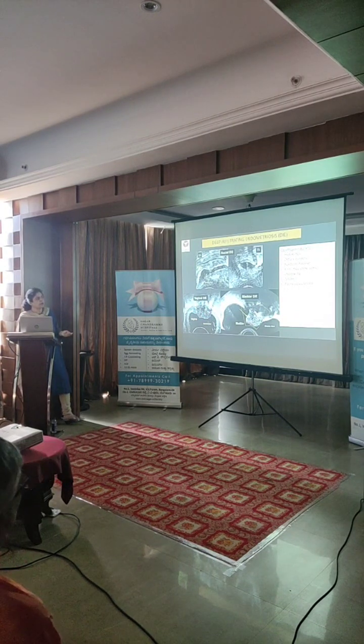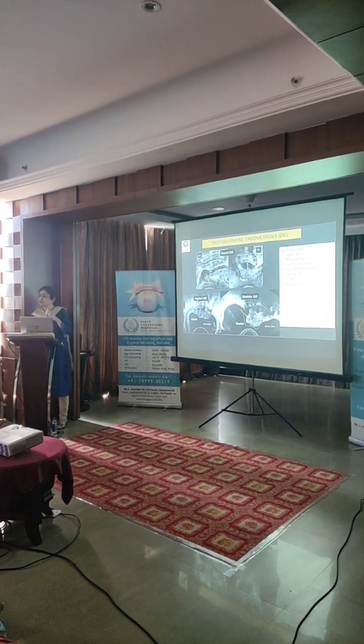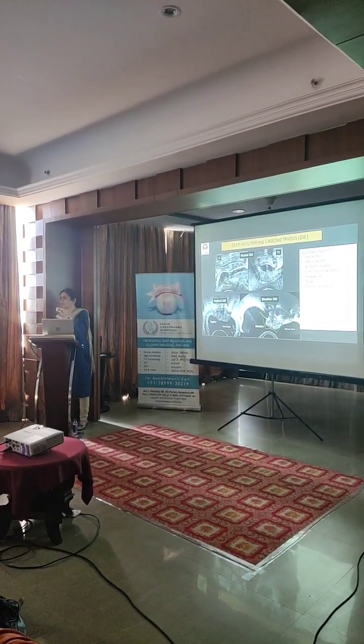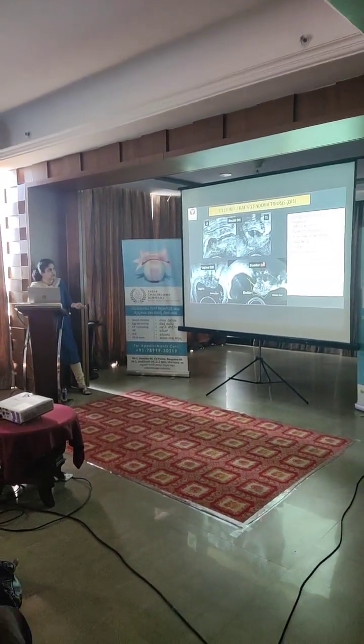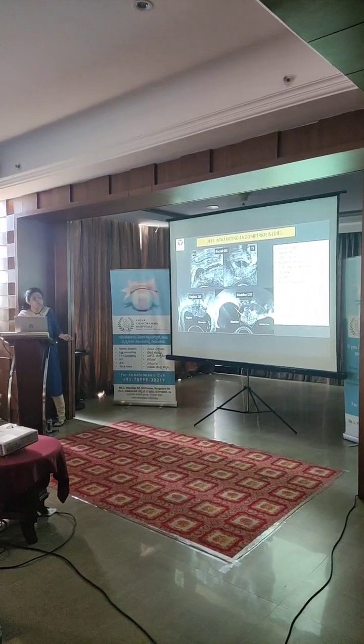They appear hypoechoic, they have diffuse borders, they appear fusiform or nodular, they are firm, they may show some amount of shadowing because the natural progression of endometriosis is infiltration, inflammation, and fibrosis. So you see this fibrosis is what causes the shadowing, as you can see over here. The lesions tend to be tender and they're mostly poorly vascularized.